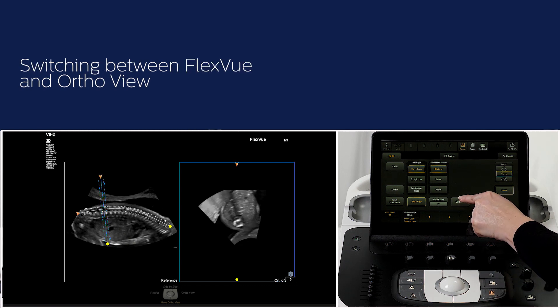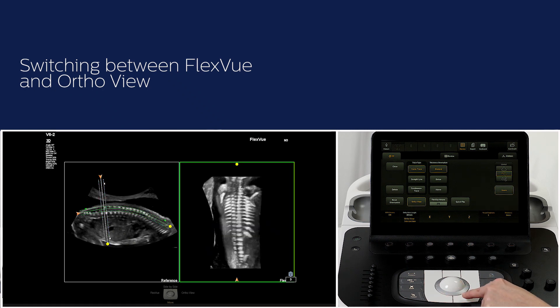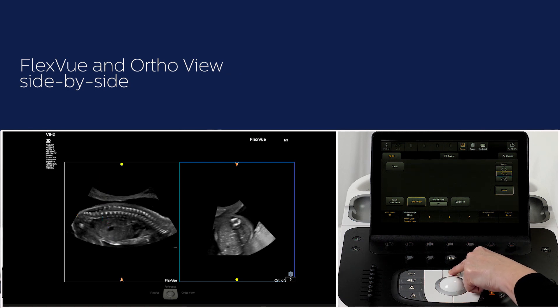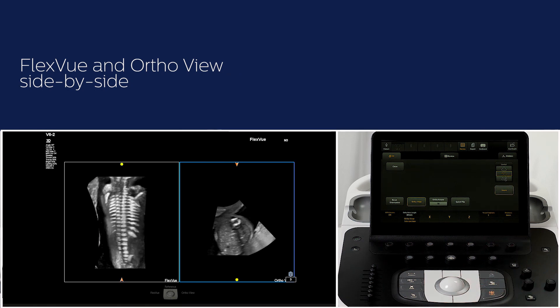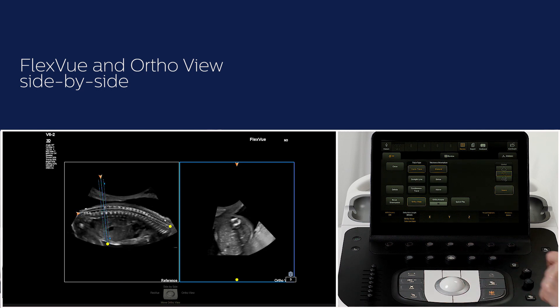Use the left and right trackball buttons to switch between FlexView and ortho view. By pressing the middle trackball button, the reference image will disappear and the FlexView and ortho view will be displayed side by side. Press again to get the reference image and ortho view back.